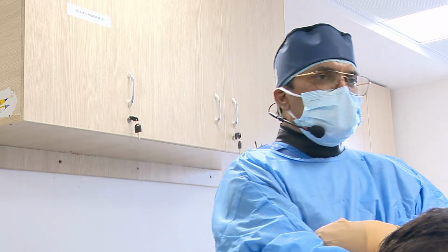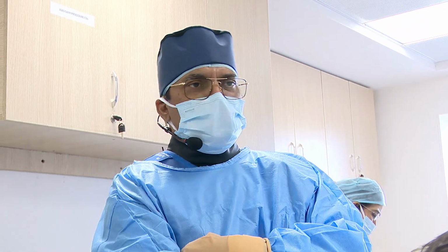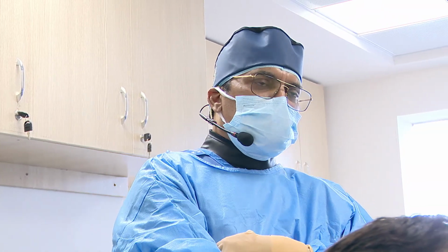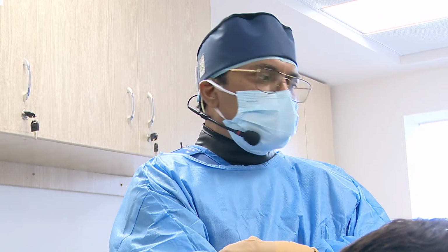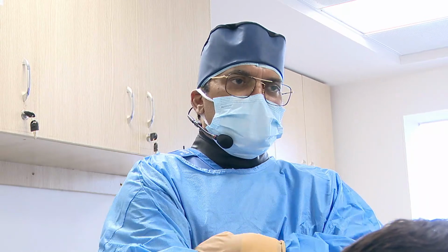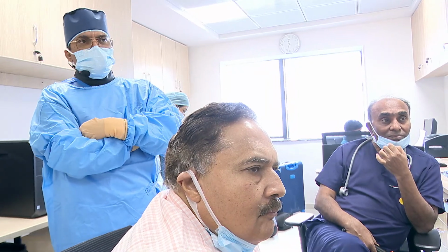If it is only a single diagonal, if you are losing the diagonal and if the area it supplies is more than 10%, that is more important. But here, anyhow, our strategy is to go with imaging acquisition. Just now the program has already been started by Dr. Reddy, senior interventional cardiologist from Kim Sunshine, and we also have a senior interventional cardiologist, Dr. Shailendra Singh. So both will be guiding, and we will be discussing while doing the case also.